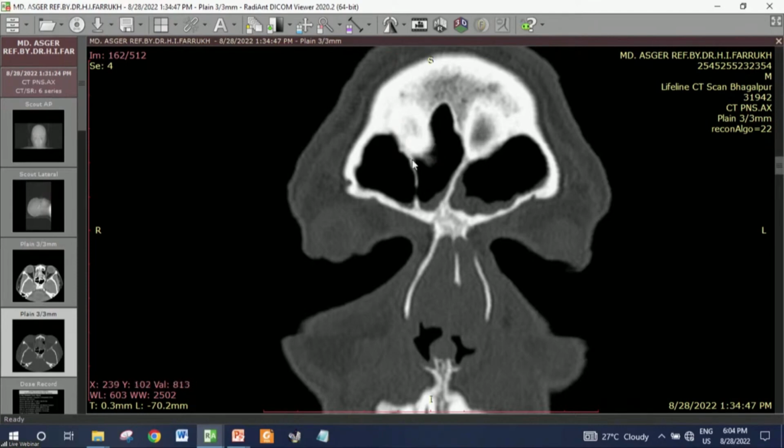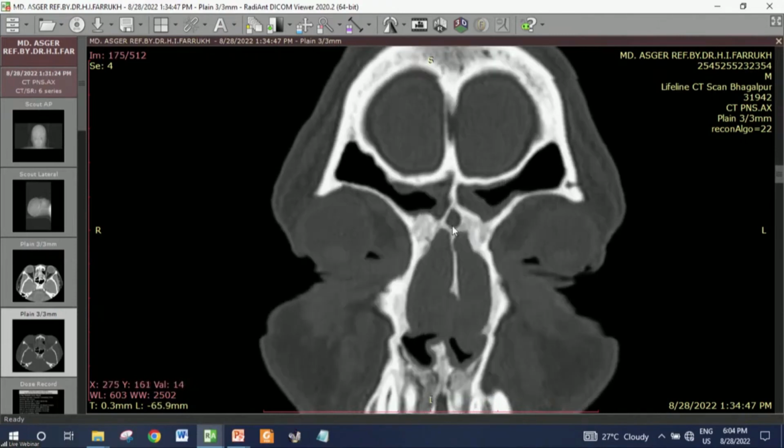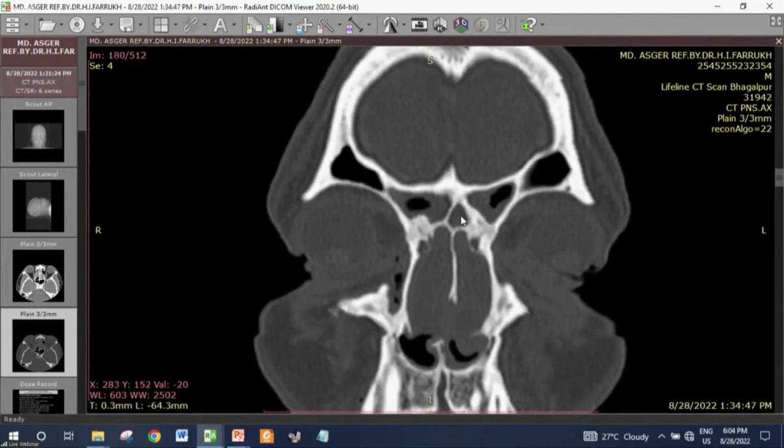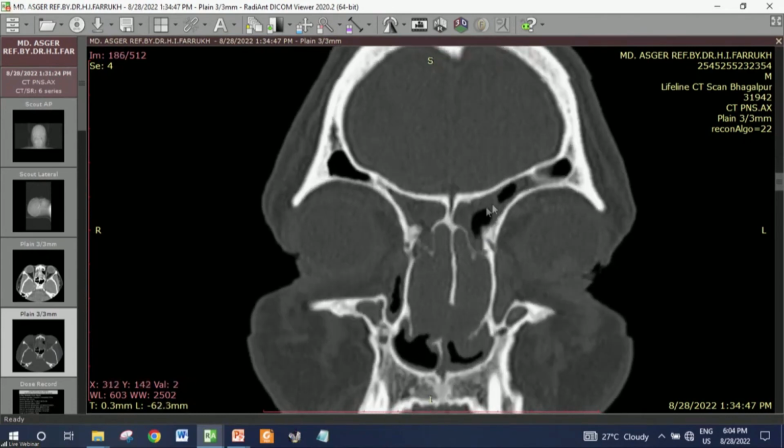So, till now, we have seen the cells which narrow the frontal outflow from medially, from laterally, from anteriorly. Now is the situation where the frontal outflow is compromised by a cell from behind. See this. These are the two frontal sinuses going behind. Can you see this intersinus septal cell? Where it is opening, keep an eye on the cell. See, it is opening on the left side.